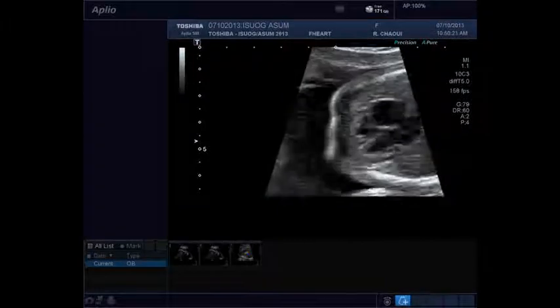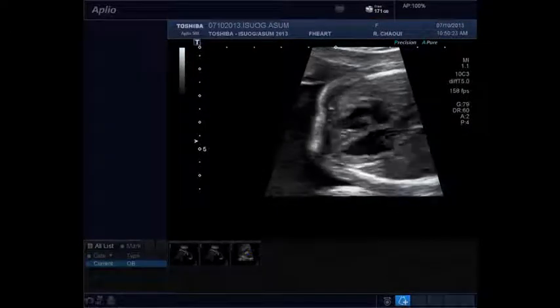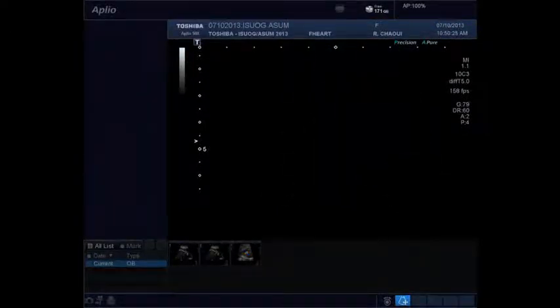Ravi, can I ask you one question? During routine screening, do you look at aortic and ductal arches in long axis views? Alfred, can you repeat the question? Yeah, the question was, in your routine scanning, do you always look at the ductal and aortic arch in the longitudinal view and the parasagittal views?